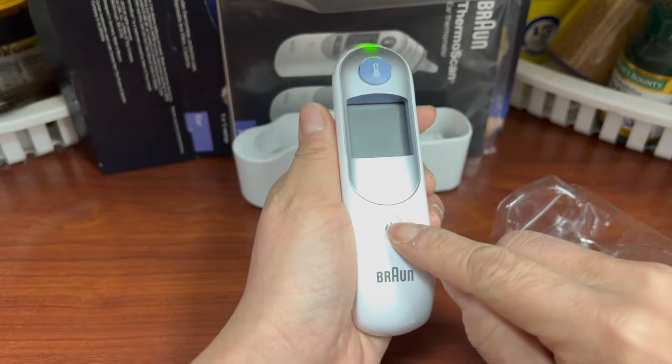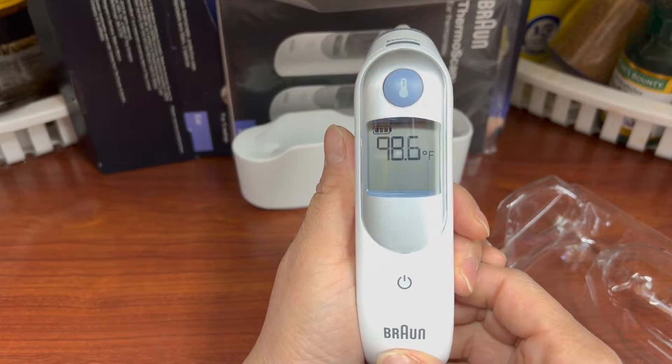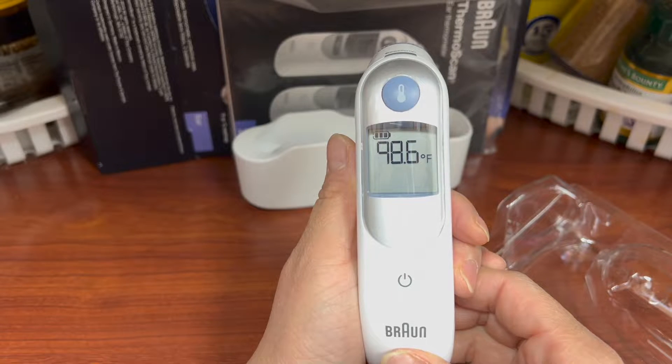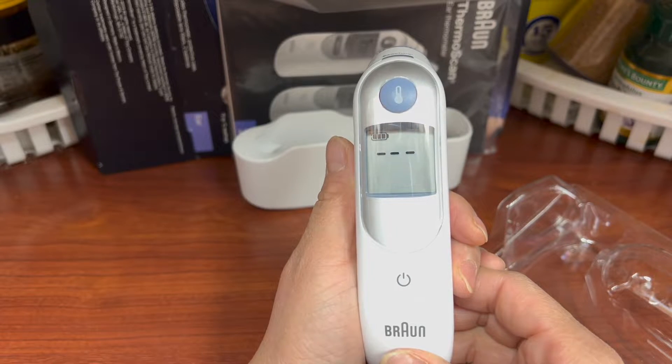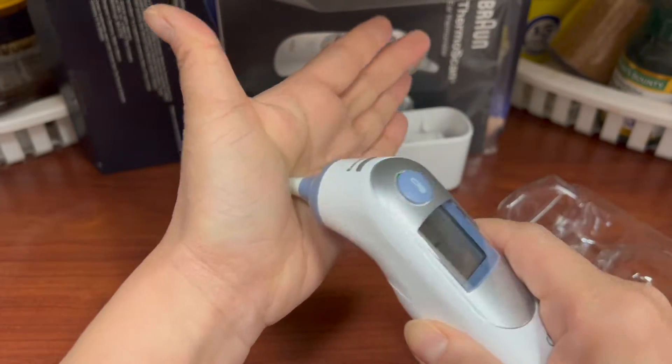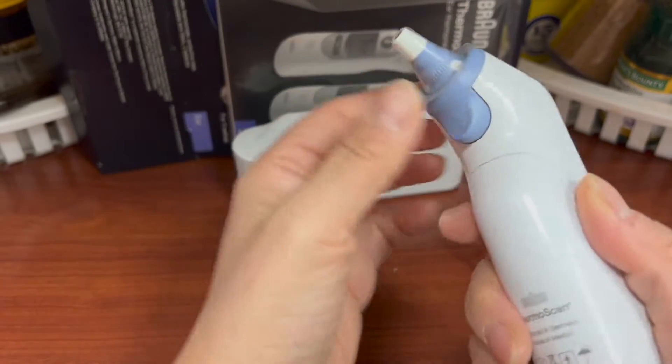Let's pull this, press the on button, and wait for three lines — like that. Then it can stick into your ear. But let me try the palm of my hand. Nope, it's not going to work.